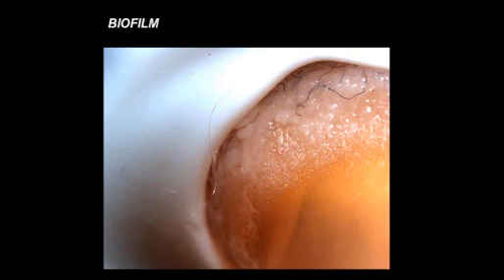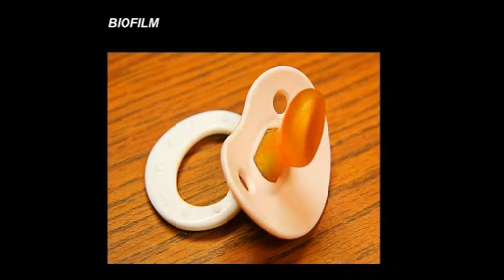Now, I want you to think what device this is. Where are you seeing this biofilm? It's important that you get a mental picture of this, because this is what biofilm looks like on the extraluminal surface, intraluminal surface, on the needleless connectors and the access sites. Well, if you haven't guessed by now, this is the device where you are observing this biofilm.